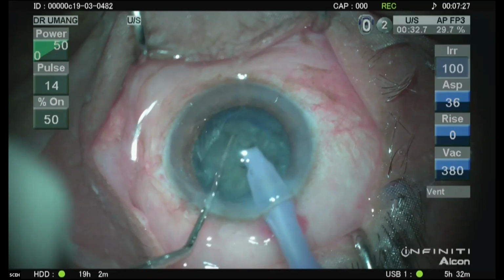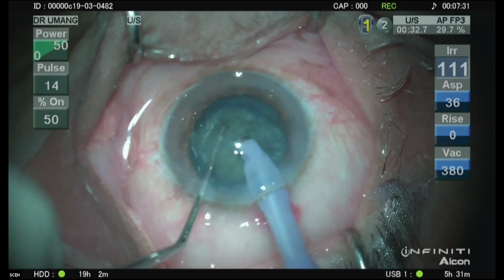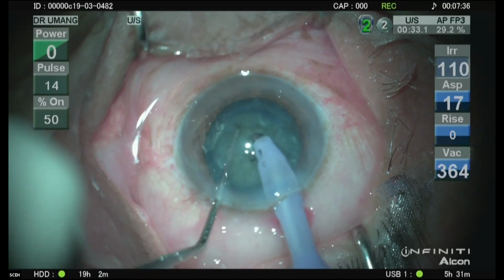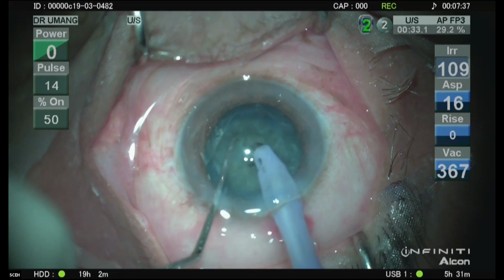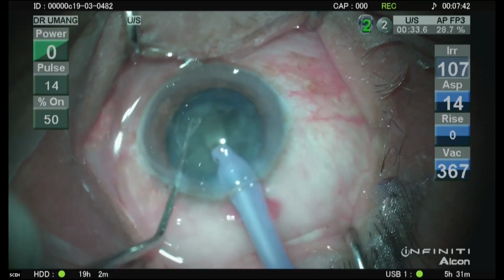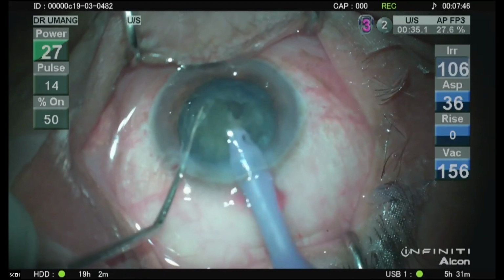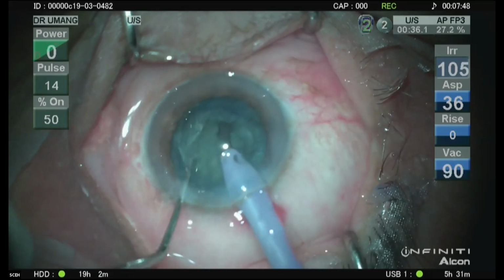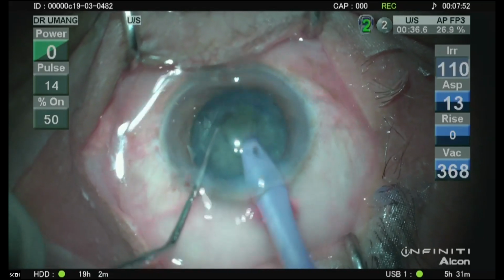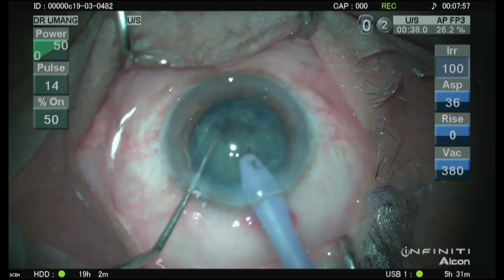So like I just discussed, instead of going like this, I'm going at an angle so that I am able to get a much bigger surface area to hold. I've generated vacuum, and now I can pull it towards the center, and now I can eat the piece. This is in pulse setting. So one more piece, and I can eat it in pulse setting.